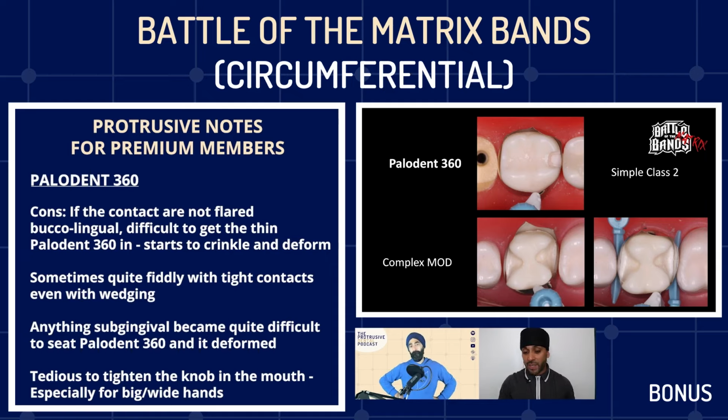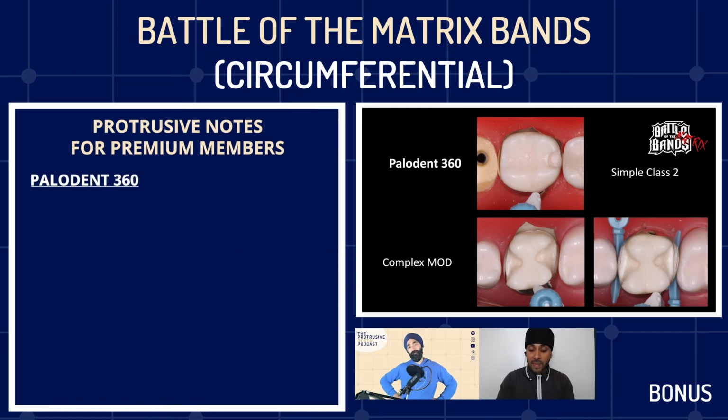And when you buy these kits, they're not cheap. These starter kits for these types of systems are very, very expensive. But we'll come back to that after. And once more, for the environmentally minded, you're going to throw away the metal plus the plastic element as well.